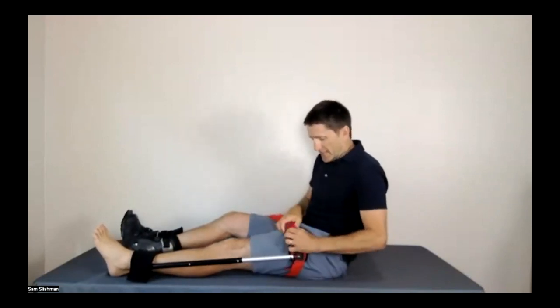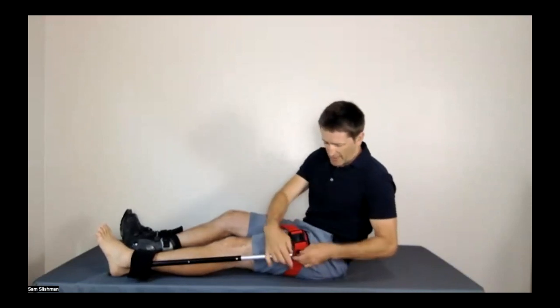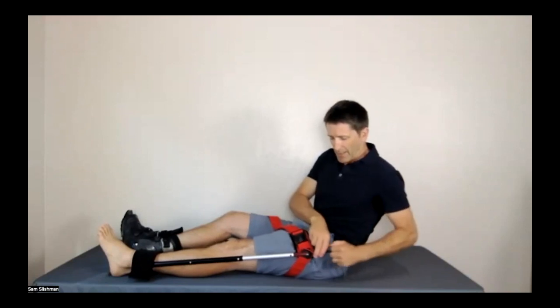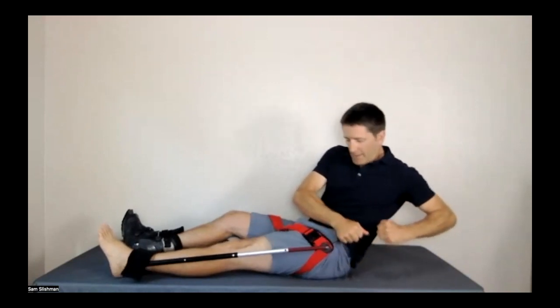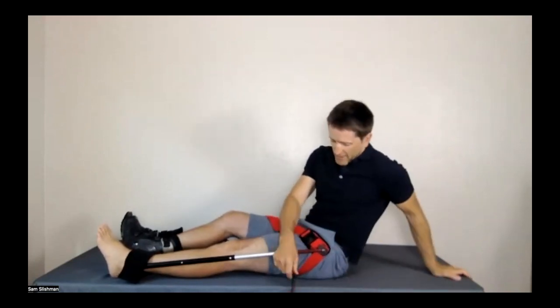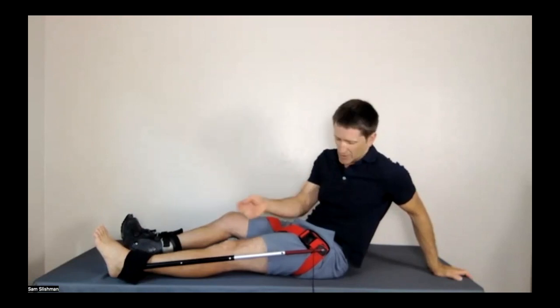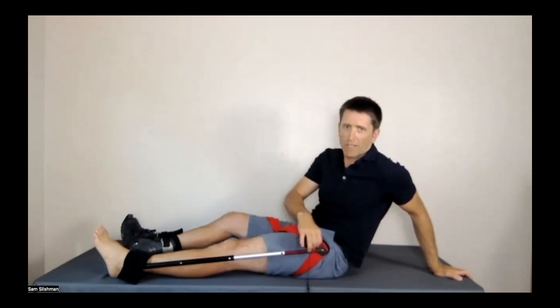I lock this in place. Doesn't have to be too tight. And then my traction comes from up here. I pull and then lock. And for the original, once it's locked in place, the cord doesn't have ongoing tension. Here, the cord is what is maintaining the tension.